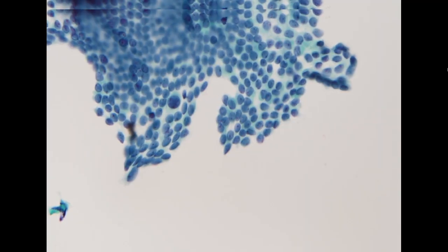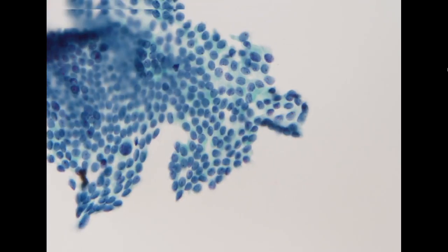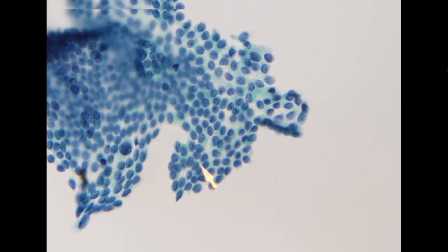And then when we go to high power, we just need to confirm the nuclear features of papillary thyroid carcinoma. These cells all show an oval shape with a little bit of disorganization, like the long axes crossing with each other.